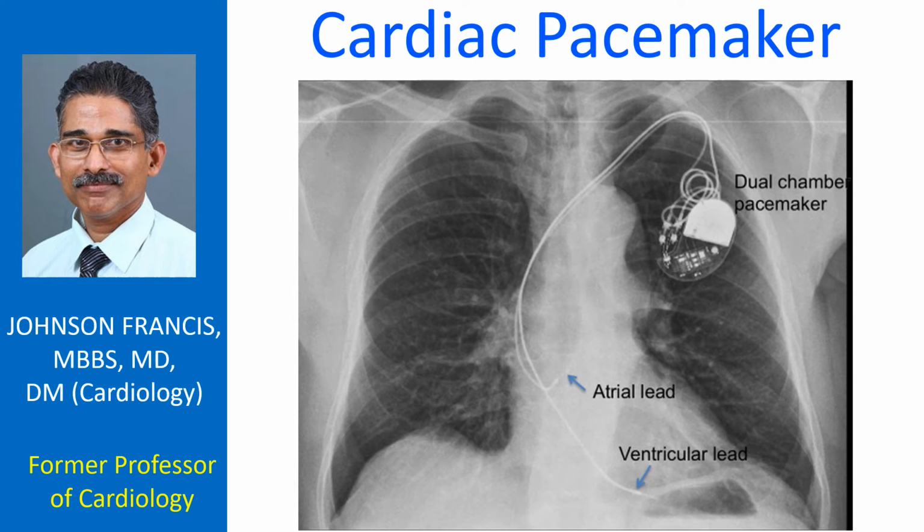Modern pacemakers have highly complex circuitry capable of monitoring the body's requirement and varying the pulse rate accordingly. They are also communicating devices which can transmit the stored information to a device known as programmer kept over the surface of the skin. Programmer can interrogate the pacemaker to retrieve important information regarding pacemaker function and malfunction. Latest programmers can send the data to a server over the internet, making it feasible for the specialized physician to evaluate complex pacemaker function sitting in another country or continent.